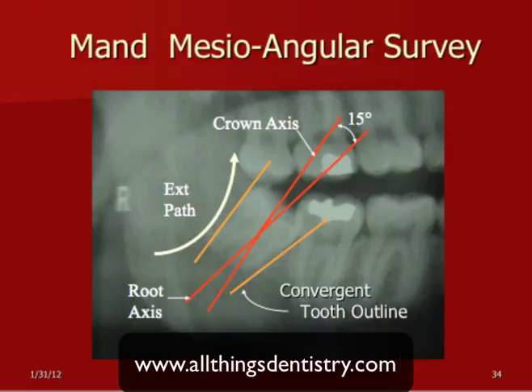Also, I'd like to point out, I think you can see it better on the next radiograph. Oh, notice also it's going to be a curved path of extraction. You can't take it straight out.